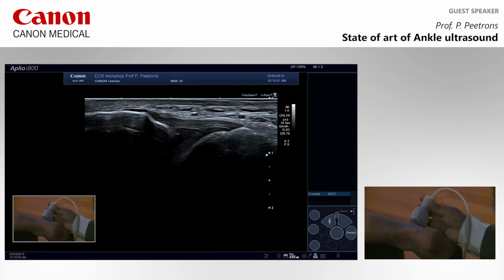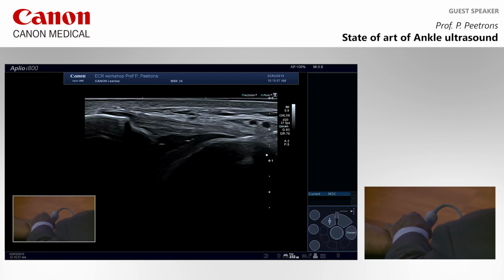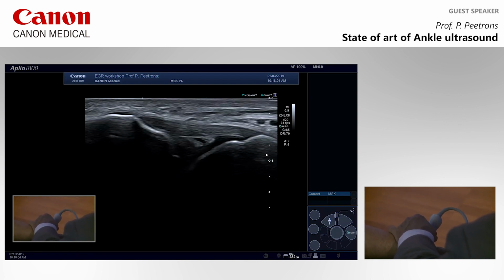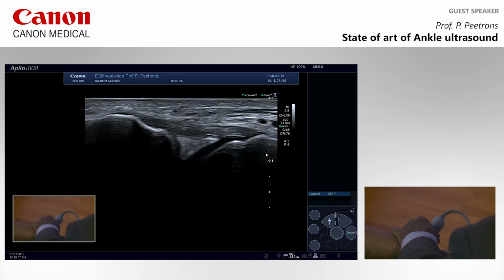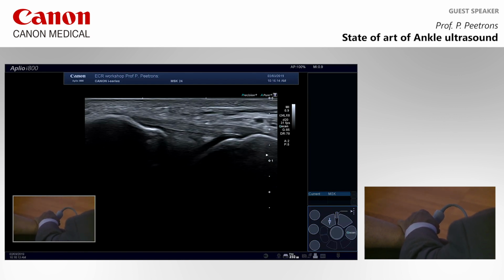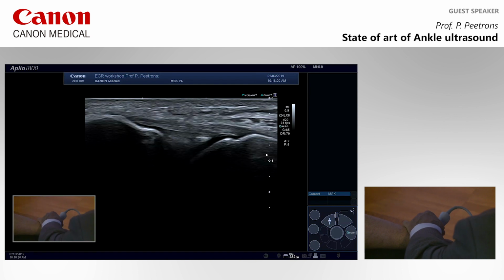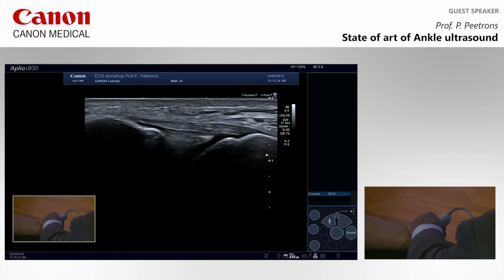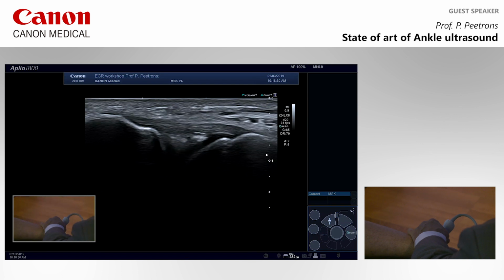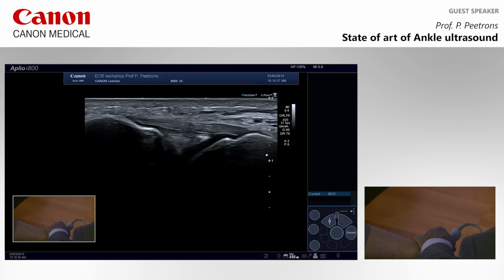Like this, perfect. So I hold the probe with my left hand, and I pull down the foot, and you see that there is absolutely no movement between the two bones. There is a movement in the joint, of course, at the deep level of the ATFL. You can see the fatty tissue of the joint moving between the tibia, the fibula, and the talus, but there is no movement of the talus itself compared with the fibula. Okay, so this is a normal appearance of an anterior drawer test of the ankle.